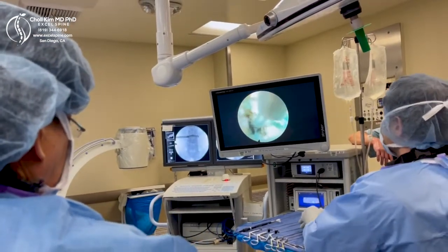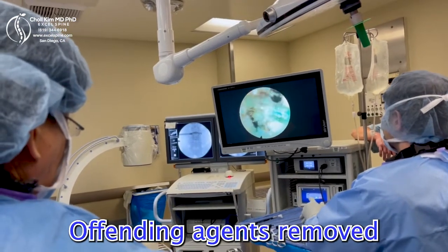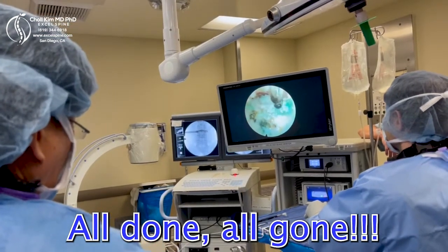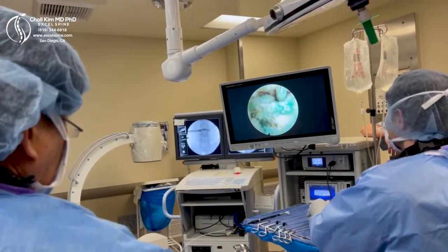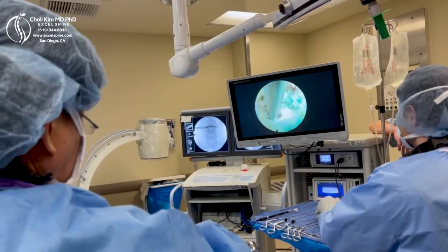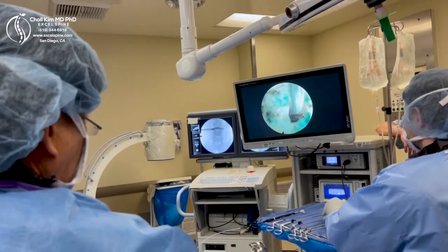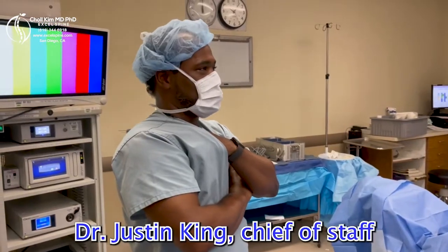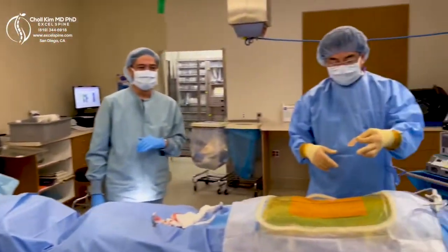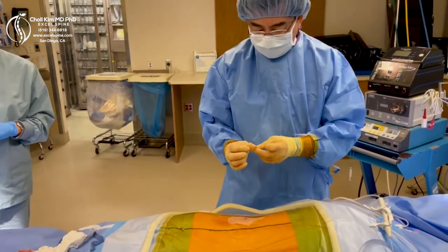Okay, there it is — the surgery went absolutely perfectly. Offending agents removed, annular tear treated, everything all done, all gone. Now just for the healing process to occur — I'm expecting you to get a great result, otherwise I'm gonna have to go on Paxil. Just doing some last-minute cleanup because I have OCD. Okay, we have Dr. Justin King, chief of staff, making sure I do a perfect job — and it's perfect, Justin. And I did it through this little poke hole.